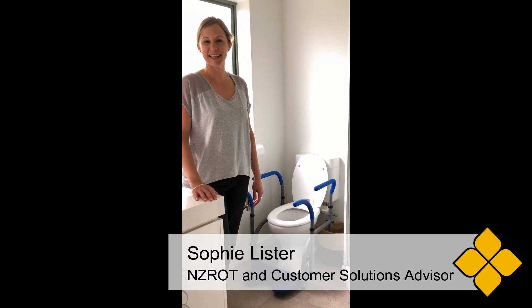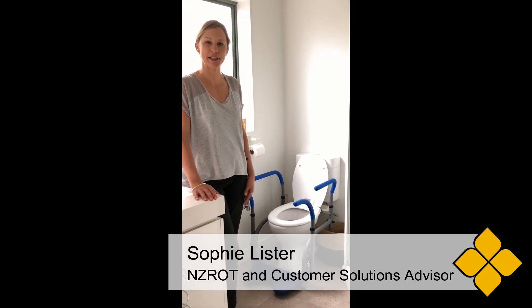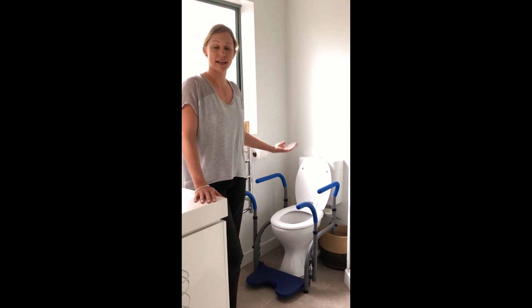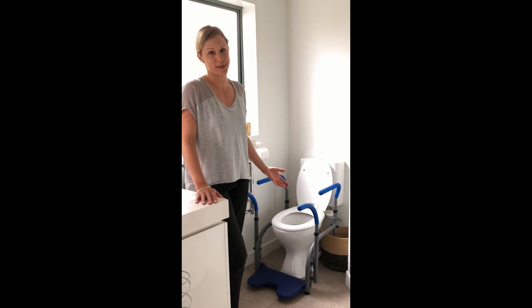Hey, I'm Sophie from Coobro. I'm here to talk to you about this Fun Care Toilets Around. This product is ideal for people who are having difficulties getting on and off the toilet and need additional support.